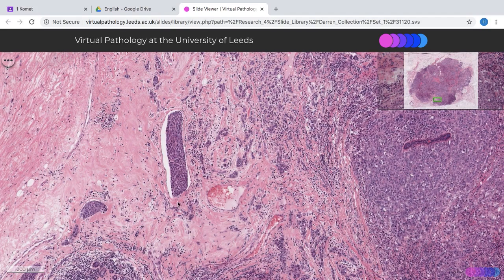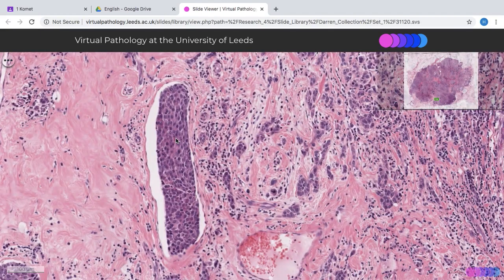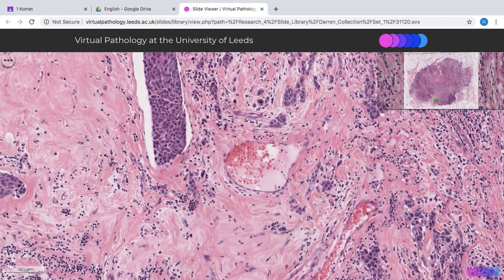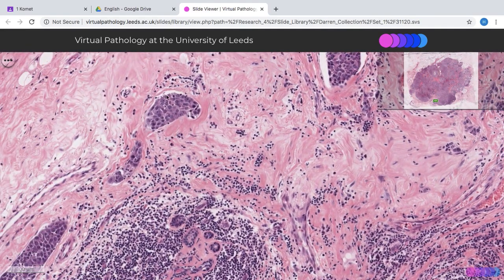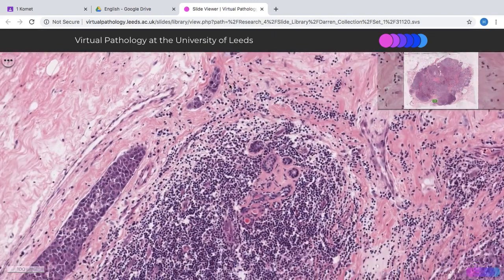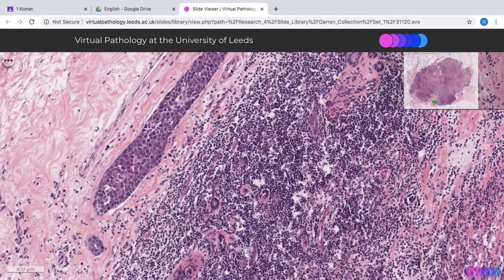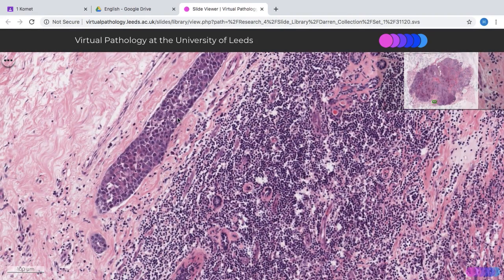Another feature present in this particular section is that this case also has several foci of lymphovascular space invasion. This is a lymphovascular space, and you can see it's lined by endothelial cells with tumor within it. Here's probably another one — space and tumor — and here's another one as well, space and tumor.